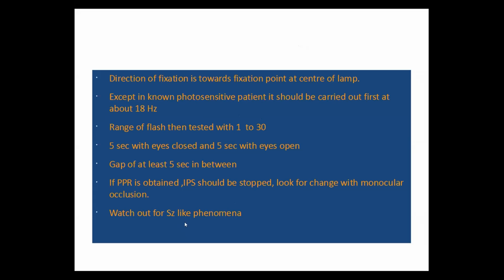First we should do stimulation at 18 hertz. Then the range is tested from 1 to 30, or sometimes even up to 50. At each frequency, it is stimulated for 5 seconds with the eyes closed, followed by a 5 seconds gap, and then 5 seconds with the eyes open.